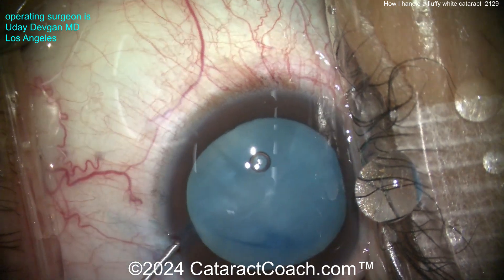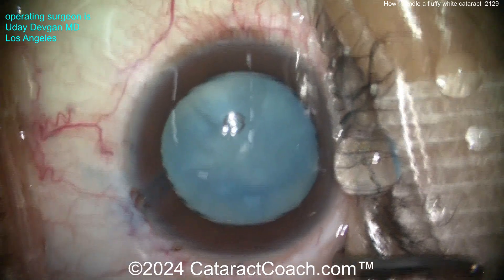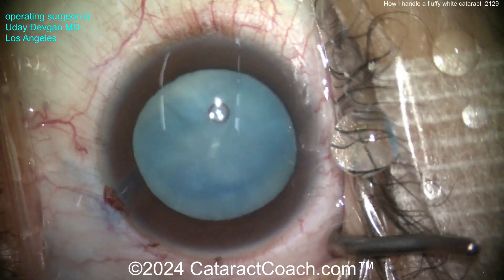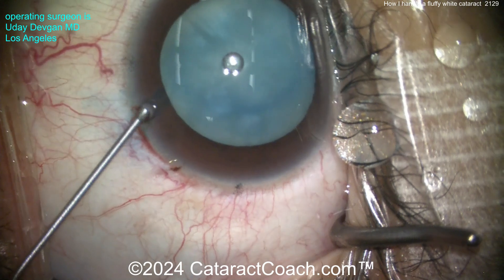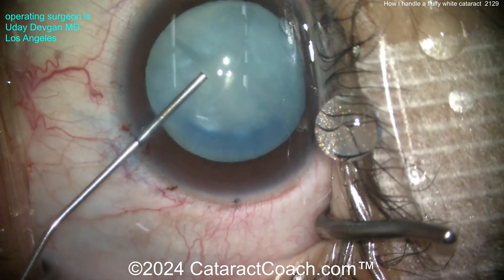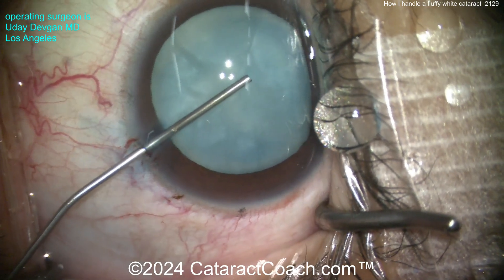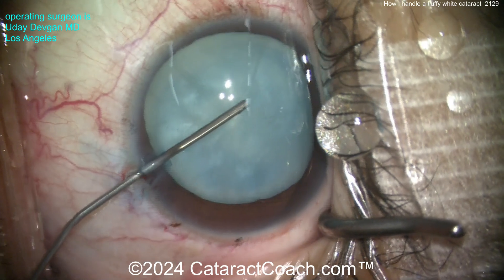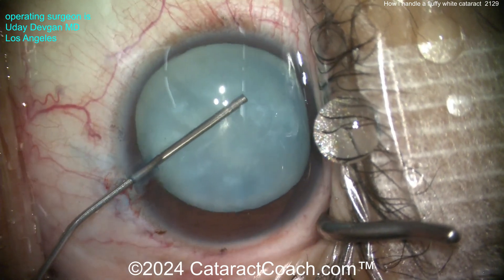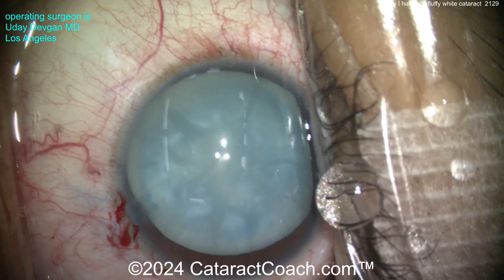Now putting in our viscoelastic. Importantly, when you put the viscoelastic in, feel that lens capsule — is it intumescent? Is the capsule bag pressurized? Putting in our viscoelastic dispersive agent inside the eye, and I'll touch that lens capsule just to check. It doesn't look too pressurized, which is a good sign. I don't want it to be too pressurized, because then it's more likely to run out and cause the Argentinian flag sign.